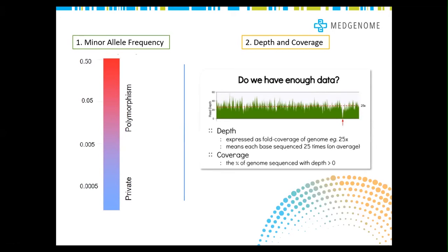The depth should be 30 or more, which is a good depth. I'm sorry, that is the depth, and the coverage of the genes is different in every patient. That is usually given in the appendix, showing that the coverage of a particular gene is appropriate for that testing.